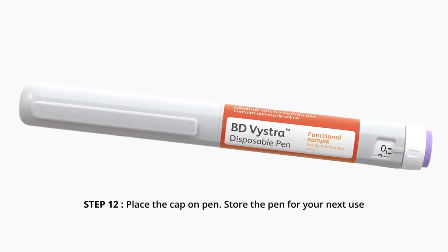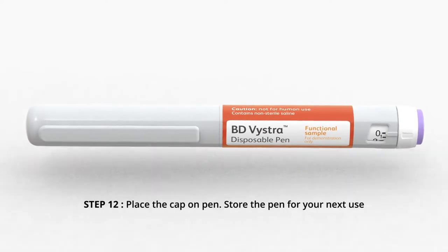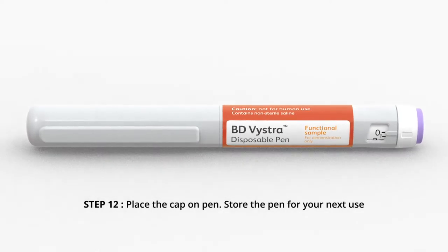Step 12. Place the cap on pen. Store the pen for your next use.